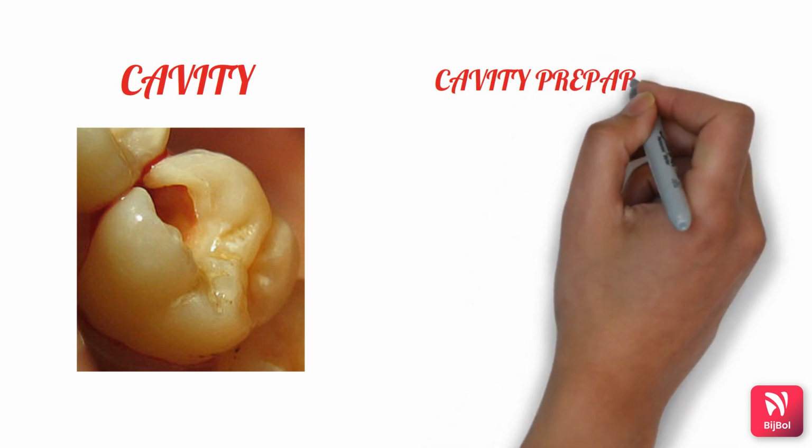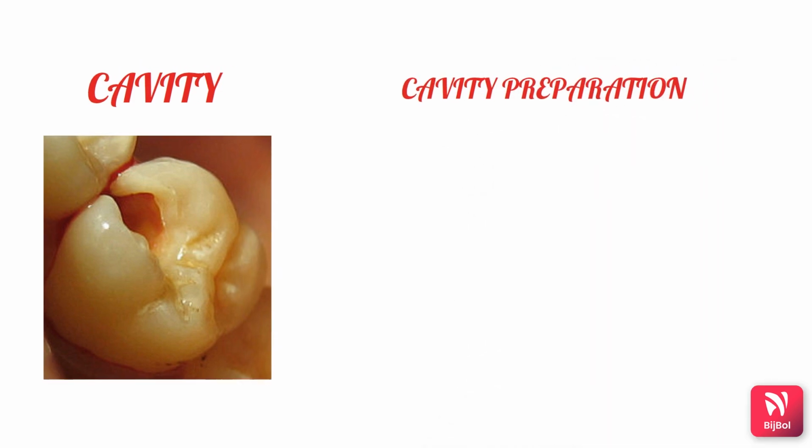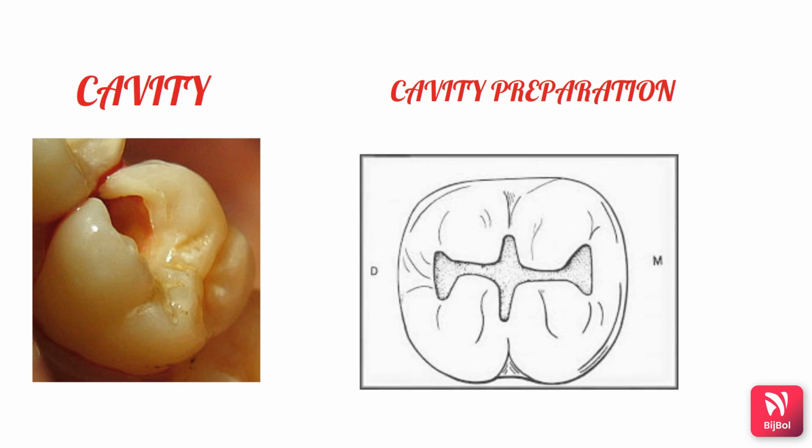So what is it? It is a mechanical alteration of the defective, injured or diseased tooth, in order to receive the best restorative material which will re-establish the healthy state of the tooth, including the aesthetic corrections with the normal form and the function of the tooth.